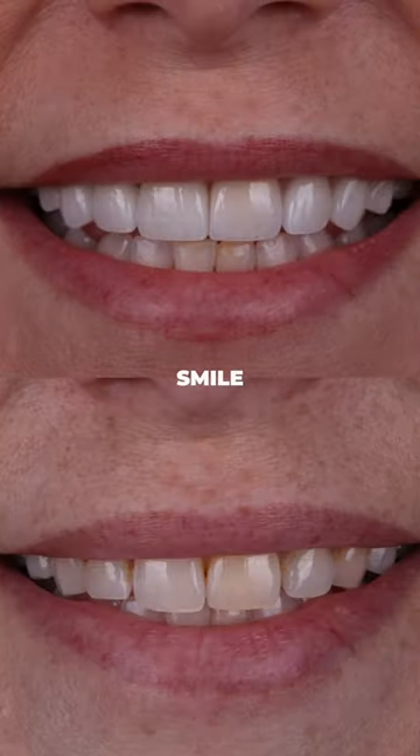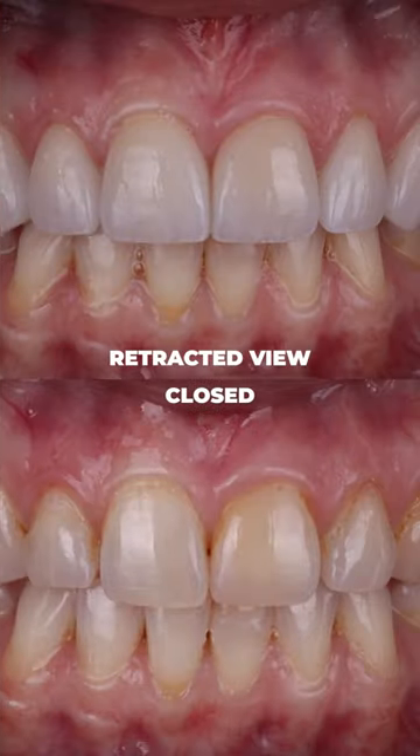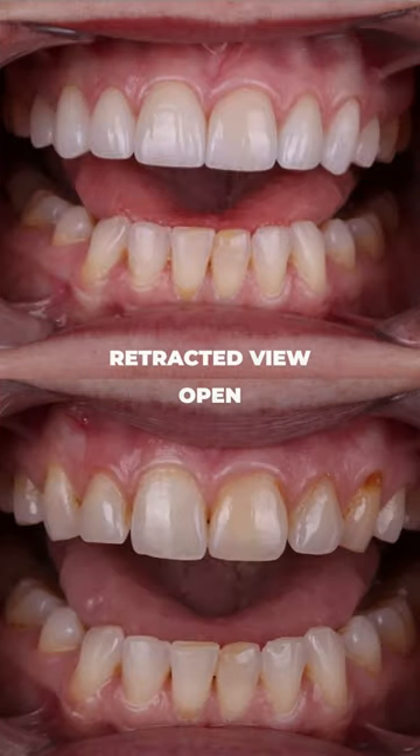We shoot a little bit closer and then I try to shoot one that runs from about eyebrows to chin, and then just smile, and then retracted view closed, retracted view slightly open.